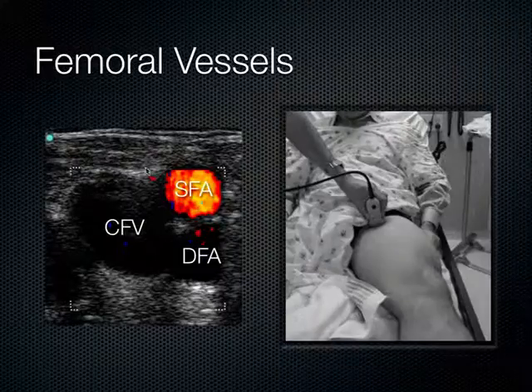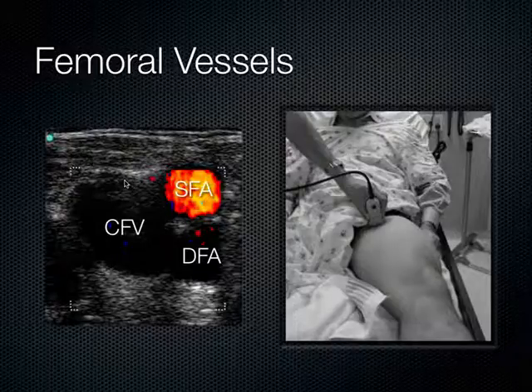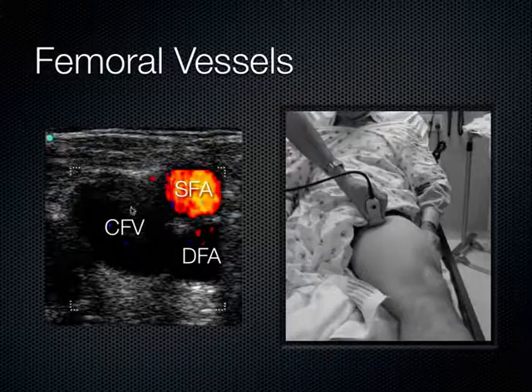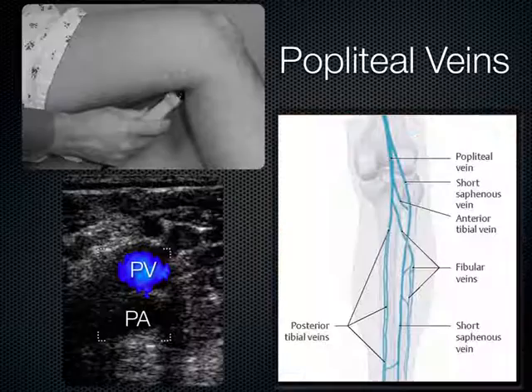And we can see here, this is a very proximal location, superficial and deep femoral arteries. Here's the common femoral vein. Notice that it's medial to the arterial structures. Venous is closer to the penis. Venous, penis, it rhymes. It's easy to remember. Sometimes you get all twisted around, you're not sure where you are. So in this case, this would be the left leg. And superiorly, we have this medial lateral configuration, but as we march distally, these structures become anterior posterior pretty quickly. And that's the location of the femoral vein.